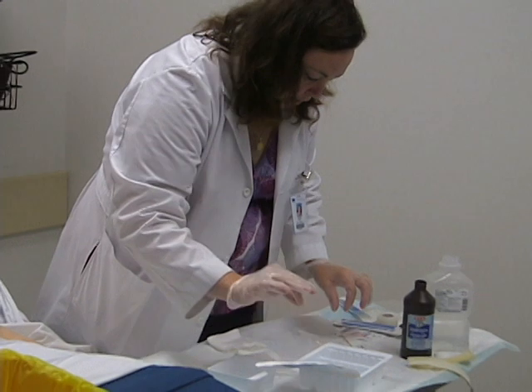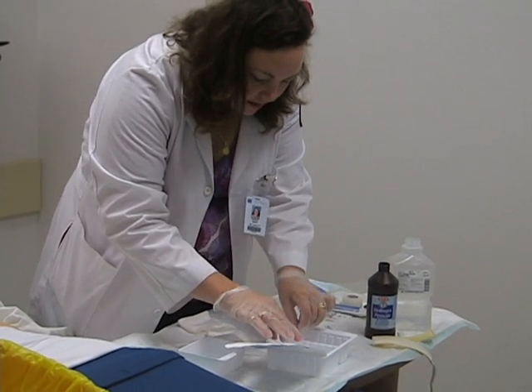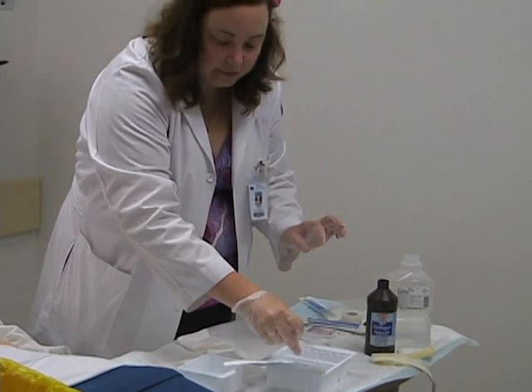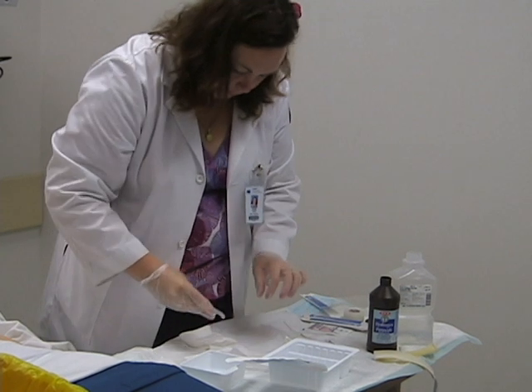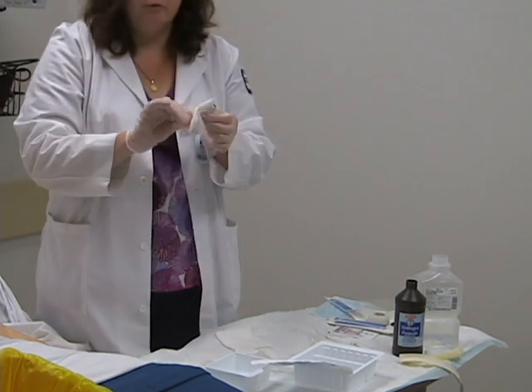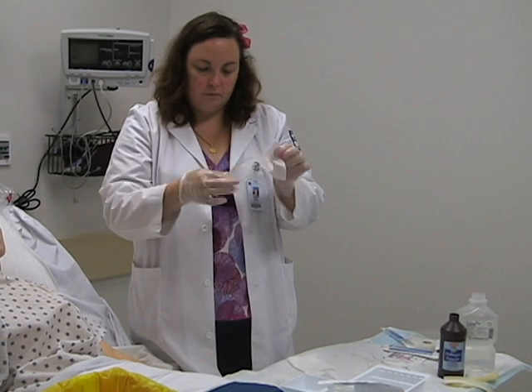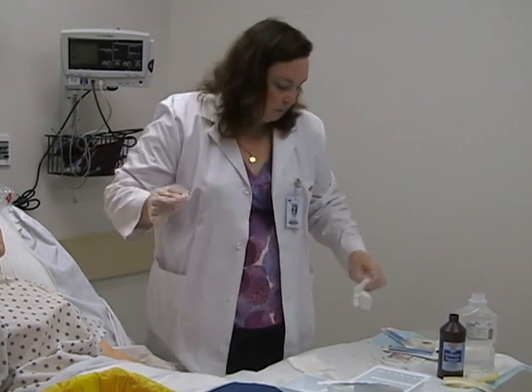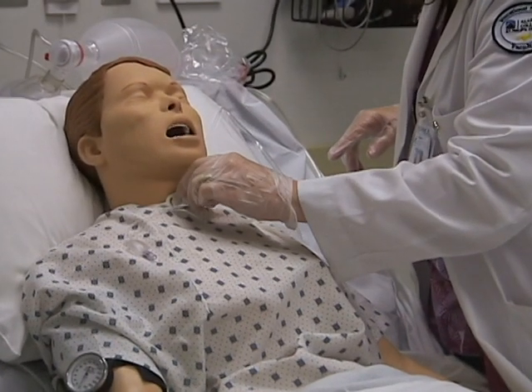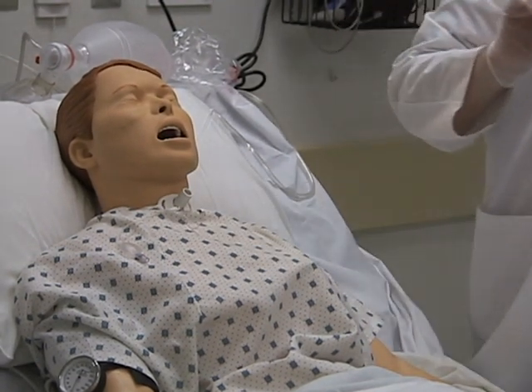Our cannula has been soaking in the saline. You want to make sure that the cannula soaks all the way through with the saline — you don't want to be inhaling peroxide. I'm going to lift it out and dry it off with sterile gauze. Using your sterile hand, you insert it. Some patients will cough when you do this. So we have our cannula replaced.